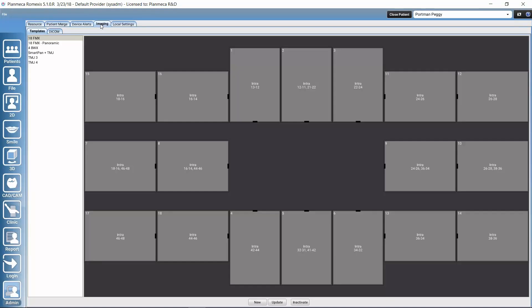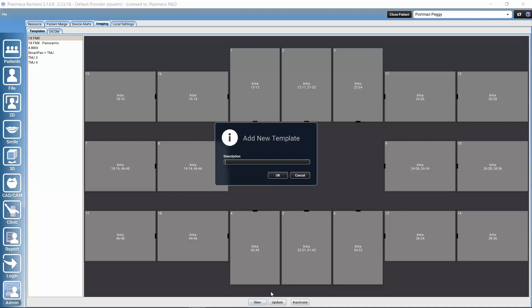Let's go to Imaging — Templates is already chosen here. This is a list of all the existing templates we have. If we want to change anything in an existing template, we can select it and click 'Update'. We could also inactivate templates if we don't need all of them. I'll start a new template from scratch by clicking 'New'.